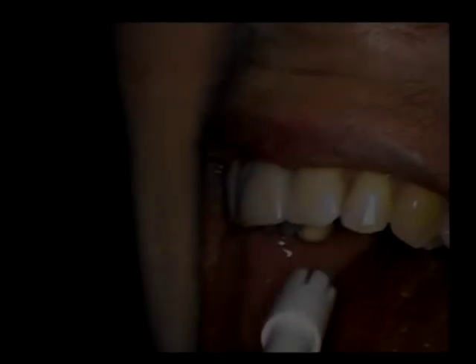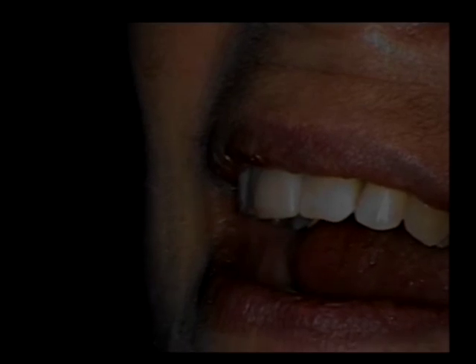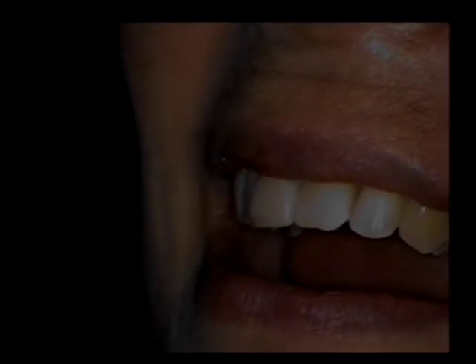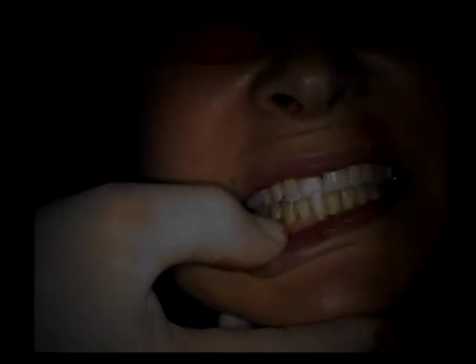What's neat about this is that normally all my work begins at this point when the surgery is done. Now my work's almost all done. Well, that was easy. This was easy. I like this.